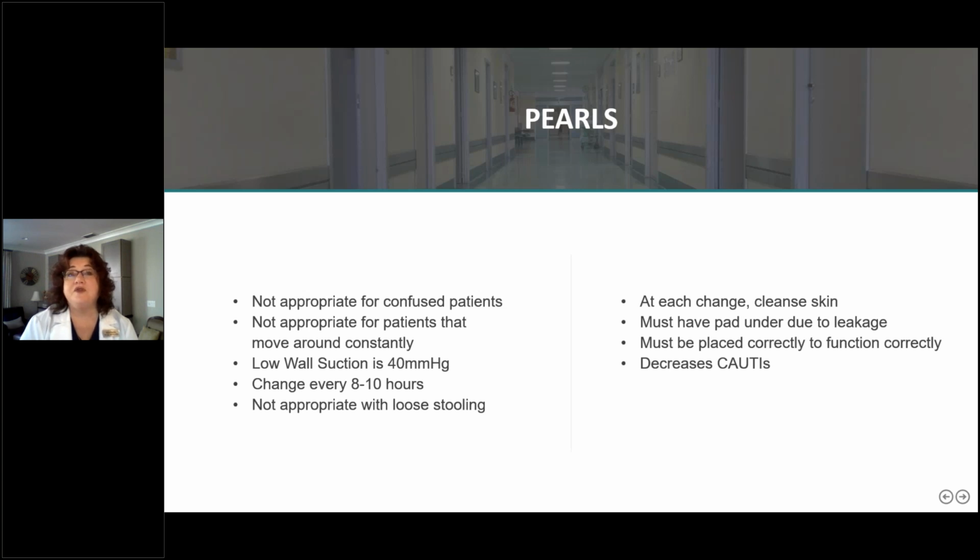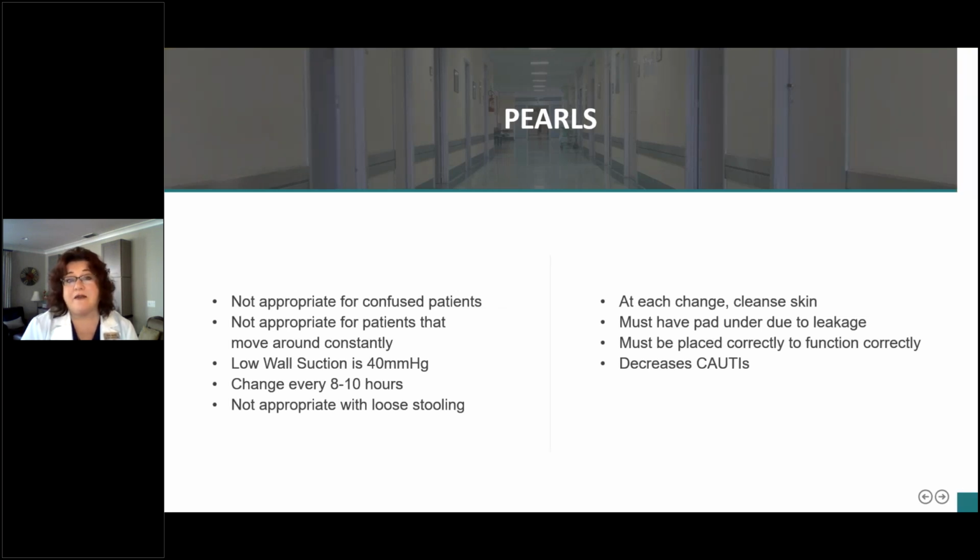And at each use, you want to clean the skin. This is sitting on the skin. Again, have a pad under them, and they have to be placed correctly. They do not go inside, and it will decrease the CAUTIs, like I said.